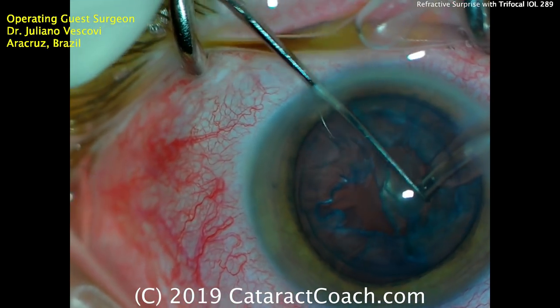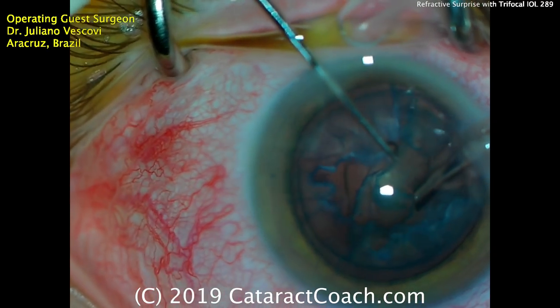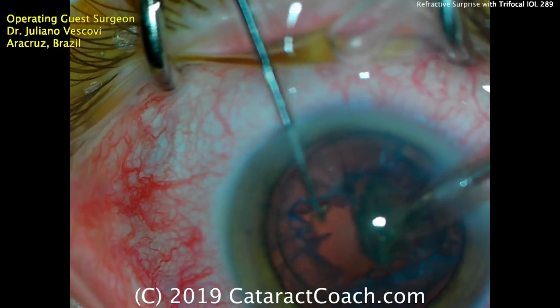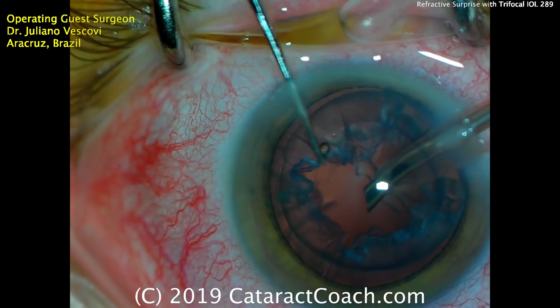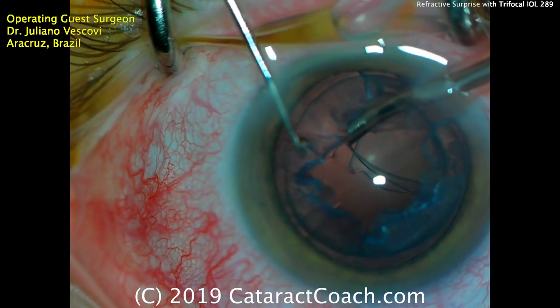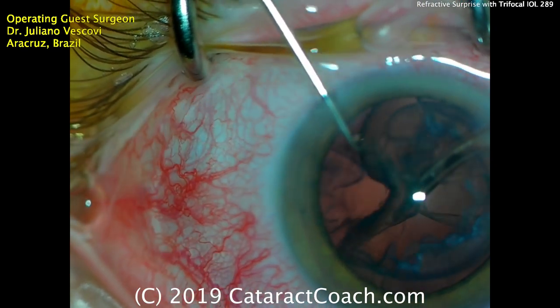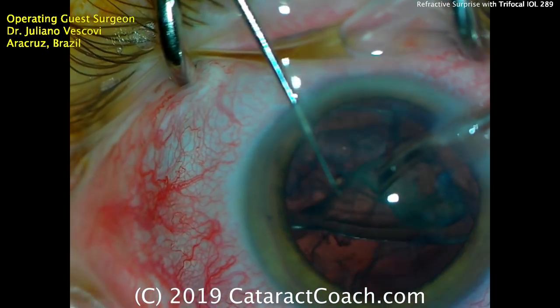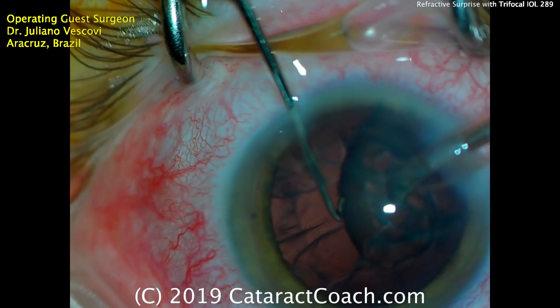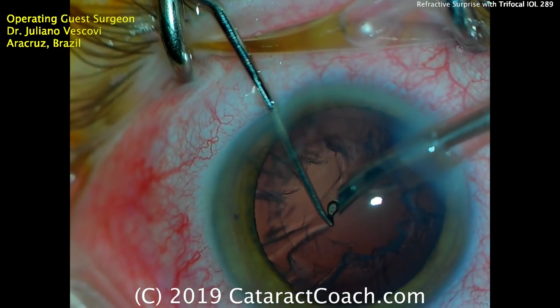When we take out the nucleus, the first piece is usually the toughest because it's the tightest fit. Once the first piece is removed, the rest of the nucleus comes up relatively easily because there's more room and maneuverability. You can use vacuum only to engage it — and notice how Dr. Vescovi pulls the probe and nuclear piece back into the center of the eye. The safest working spot is at the iris plane in the center of the eye, about halfway between the corneal apex anteriorly and the posterior capsule posteriorly. Here's the epinuclear shell being brought up with just vacuum, teasing the whole shell out of the bag — easily aspirated. There was an epinuclear shell because there was hydrodelineation to split it apart.